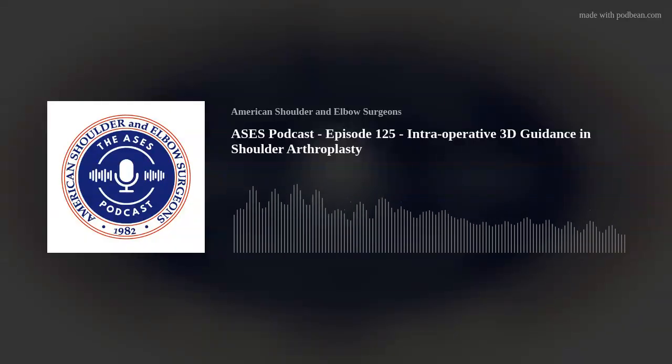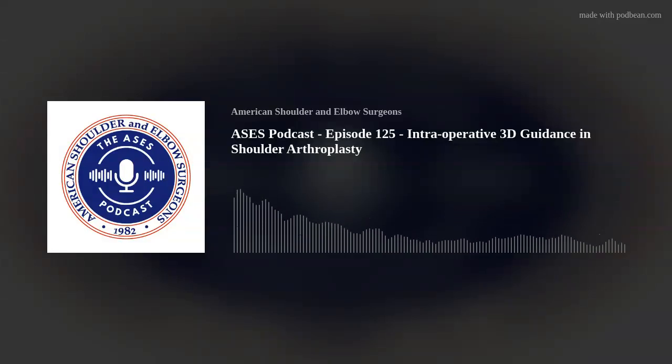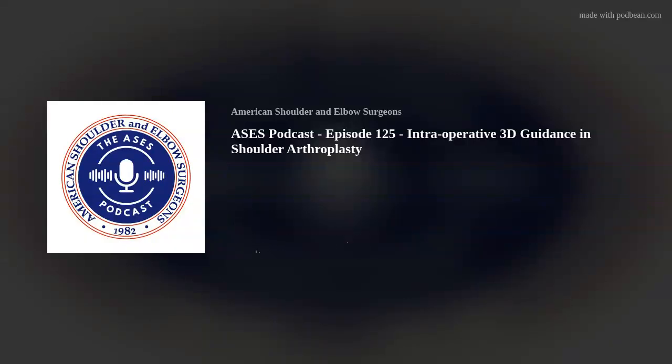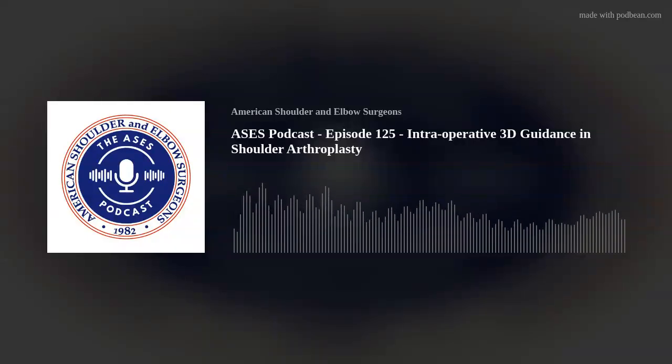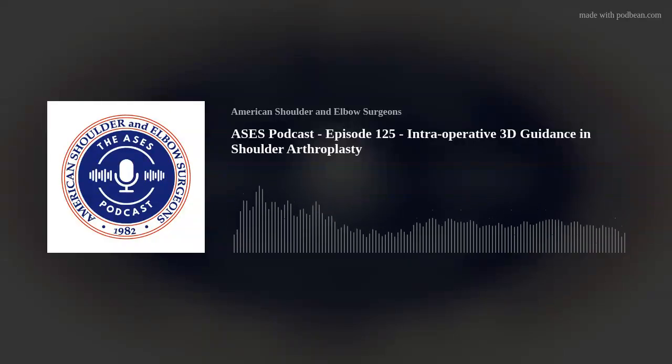Okay, so I want to start with planning. Let's start with you, Dr. Raniga. Are you planning every case, or are there times when you're comfortable to do an arthroplasty with plain radiographs alone? Peter, I plan every single case. I do 3D planning for every single case I do. There'll be the odd case where the planning software doesn't allow accommodation because of metalware or some other issues, where I won't. But even then, I manage to get around some aspects of that and plan every case I do.